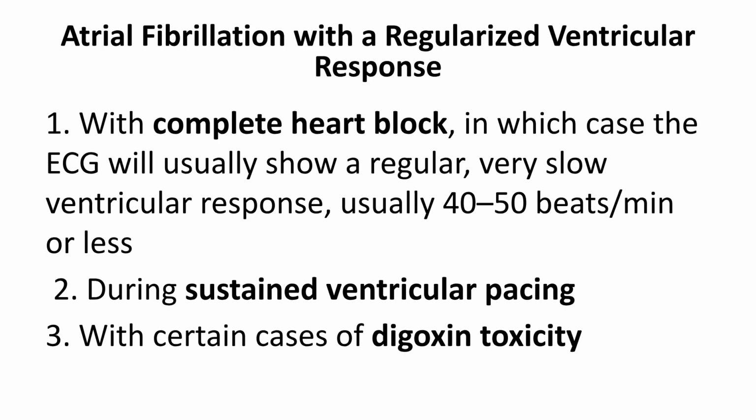Atrial fibrillation with a regularized ventricular response can be seen in cases of complete heart block, during sustained ventricular pacing, or with certain cases of digoxin toxicity.